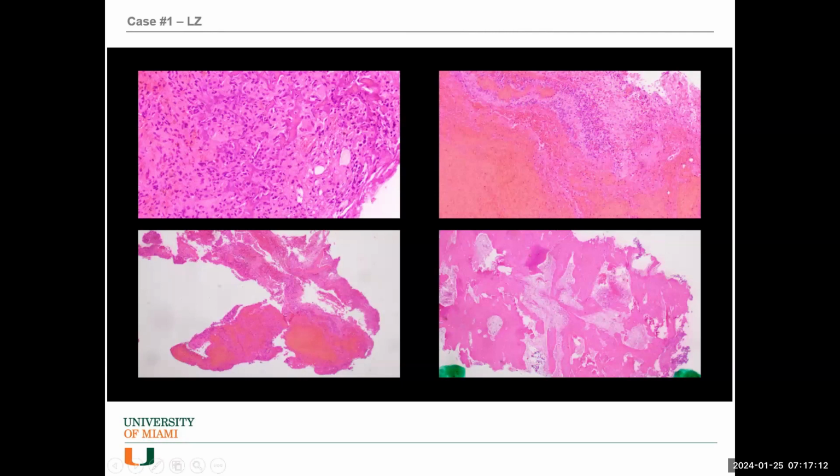Okay, so once carcinoma is out, then you start thinking, is there a primary bone or soft tissue lesion? Like giant cell tumor of the bone, osteosarcoma, chondrosarcoma, all sorts of other things. And they didn't make sense either with this morphology. As you can see, irregular areas of bone formation, blood, these streaks of bone associated with cartilage, again, spicules of bone, osteoblastic activity on one side, osteoclastic activity on the other side, as seen in the right upper picture. It just didn't make sense in terms of metastasis or primary bone and soft tissue tumor, this particular specimen.